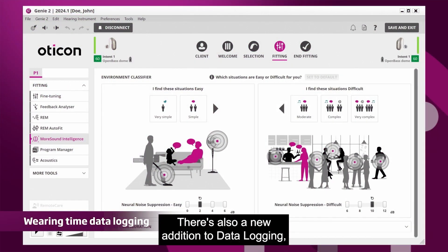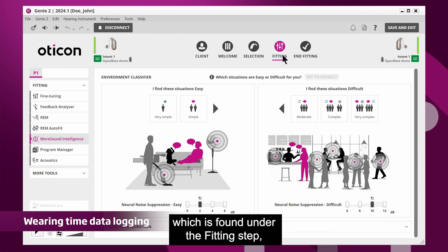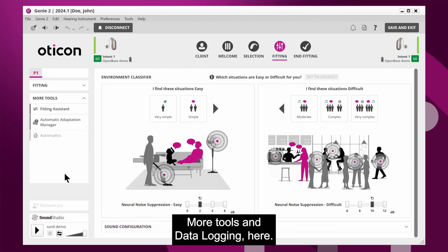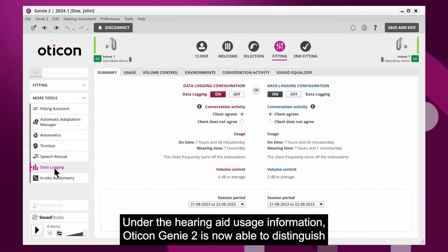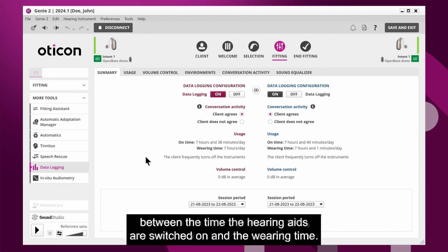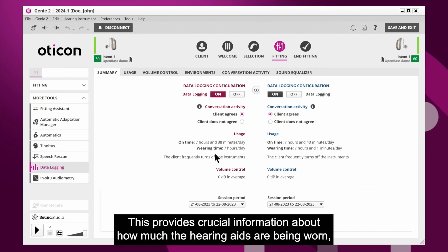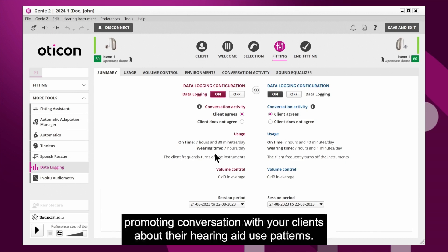There's also a new addition to data logging, which is found under the fitting step, more tools, and data logging. Under the hearing aid usage information, Oticon Genie 2 is now able to distinguish between the time the hearing aids are switched on and the wearing time. This provides crucial information about how much the hearing aids are being worn, promoting conversation with your clients about their hearing aid use patterns.